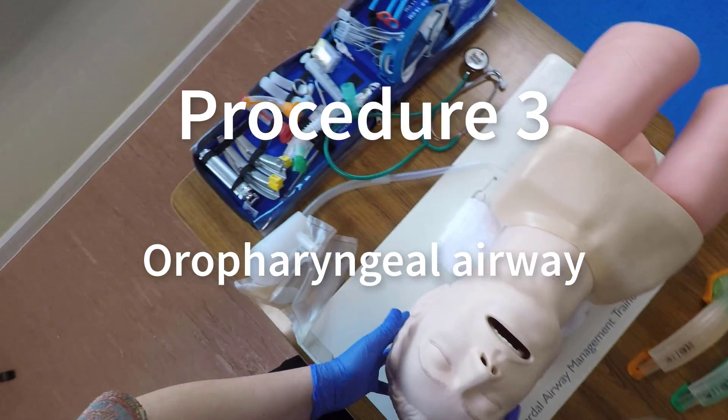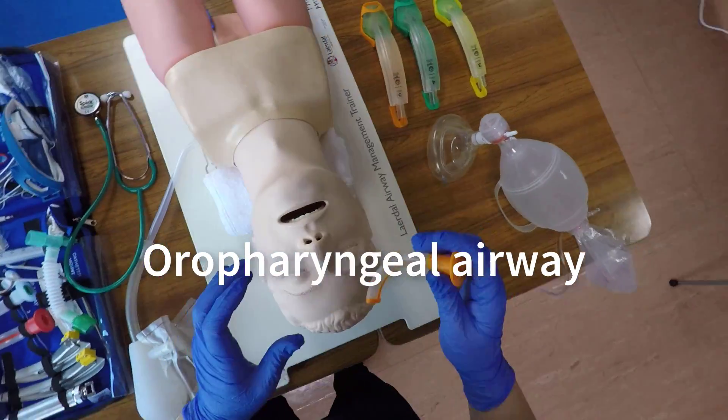Open the patient's mouth and ensure that it's clear. Check for any foreign bodies, vomit, blood, or secretions.